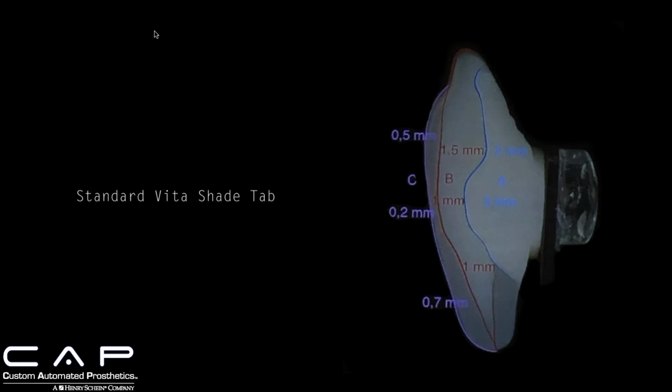So this is an interesting photo, and this is a snapshot of a lecture when I was in Los Angeles. Mr. August Ruggero was talking about shade tabs and batch discrepancies, which we'll talk about in a few minutes. But this is a standard Vita tab spliced in half with different measurements of what's going on, and it's pretty eye-opening. You know, each one is made practically the same.